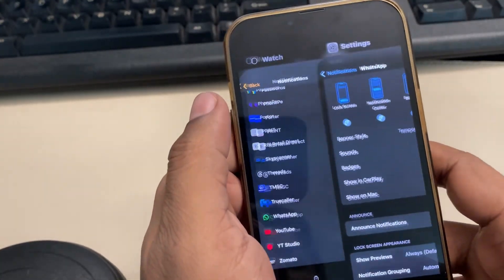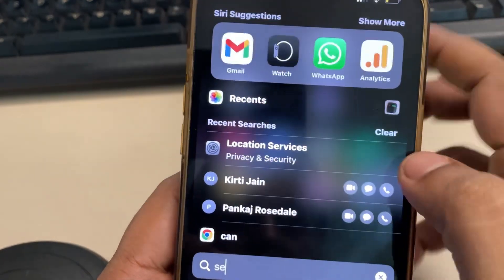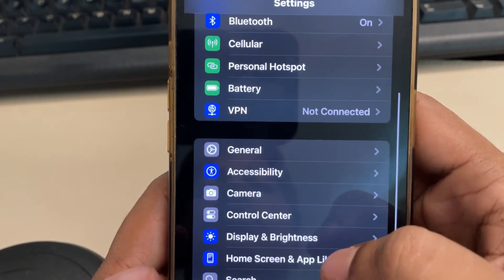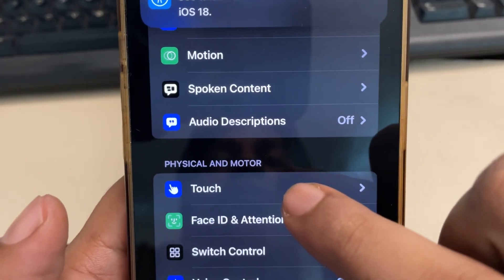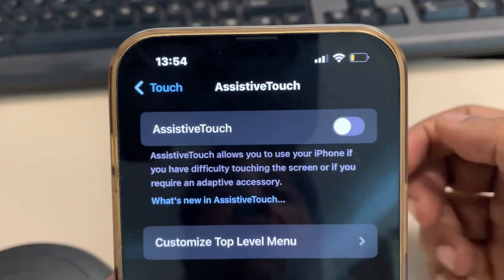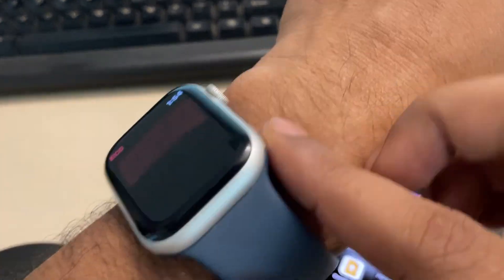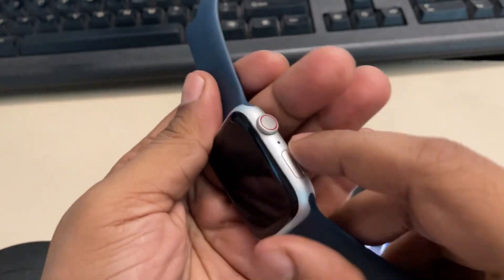Open your iPhone which is connected to the Apple Watch. Go to Settings, then go to Accessibility, then go to Touch. If you have AssistiveTouch on, turn it off and then try the ECG again.